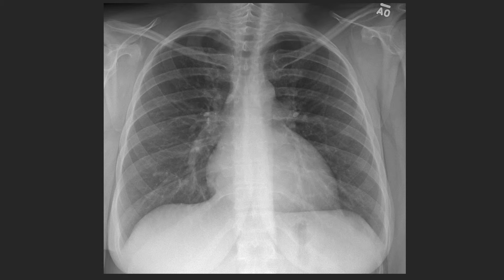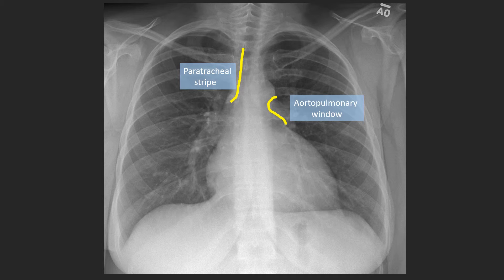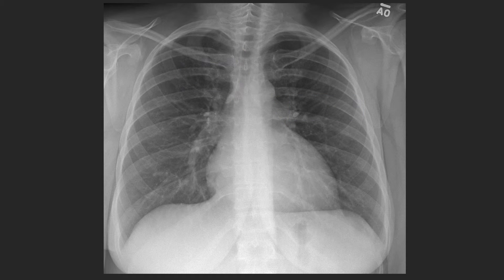We can also notice some lines and stripes. The first is the right paratracheal stripe — the portion of the trachea that interfaces with the lung and mediastinum. Another is the aortopulmonary window, or AP window, a concavity just below the aortic knob created between the aortic knob and the main pulmonary artery — normally there should be a concavity. We can also see the descending aortic stripe, which represents the outer edge of the descending thoracic aorta, extending inferiorly from the aortic knob.